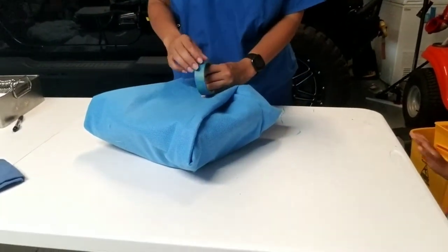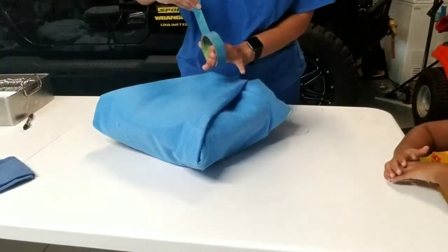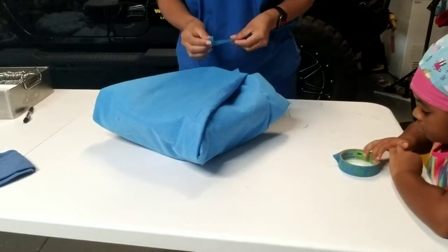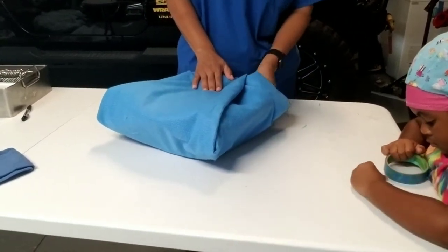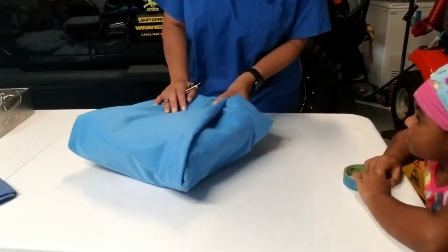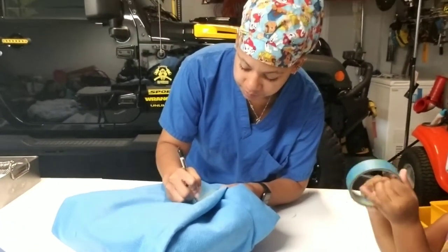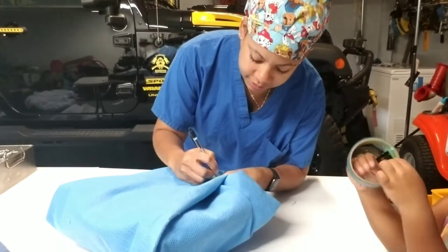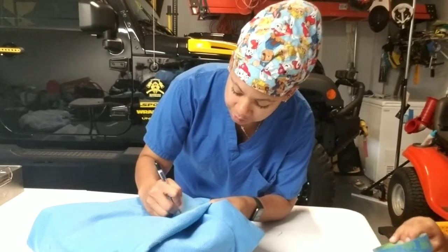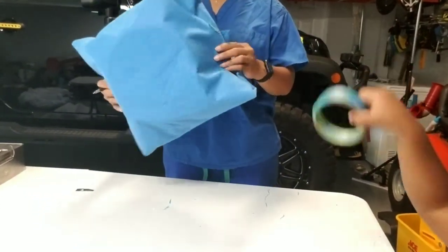Tape it first — this blue painter's tape represents the indicator tape used in SPD, which changes once the item has been sterilized. Then label it: date, what it is (a basin set), and the initials of the person who sterilized it. Nice, tight, and clean.